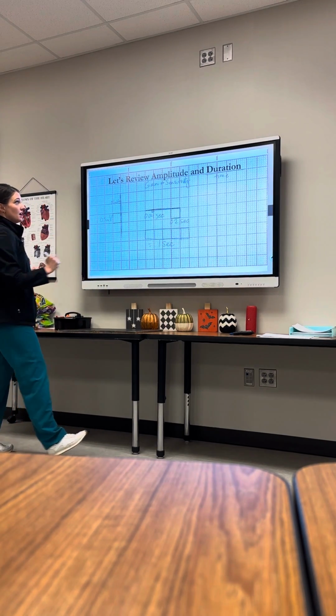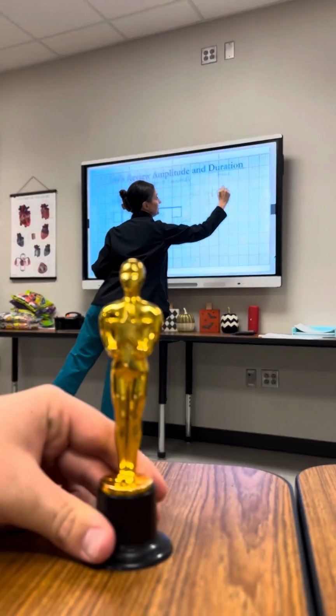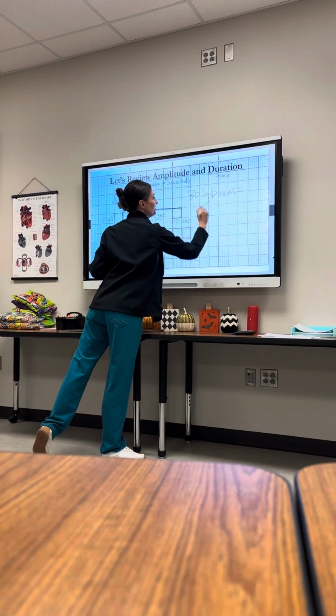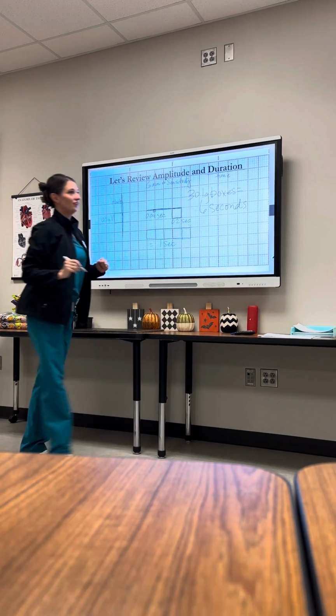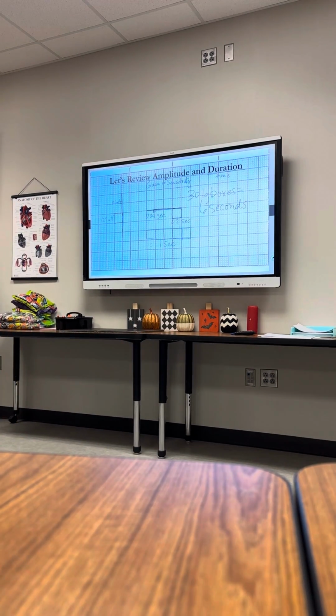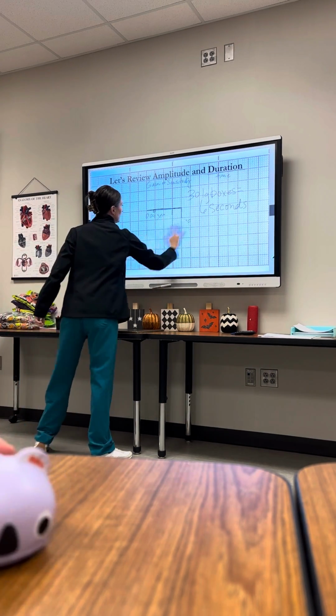Very good. 30 large boxes equals 6 seconds. Very good. Are we feeling okay, a little bit tapped into our amplitude and duration as we get into today's lesson?